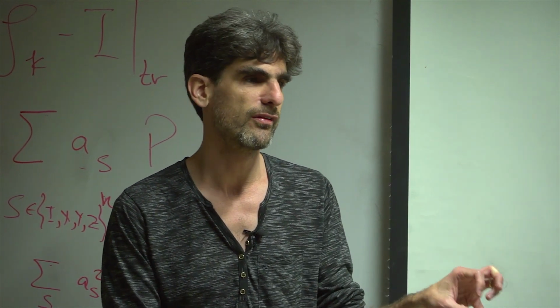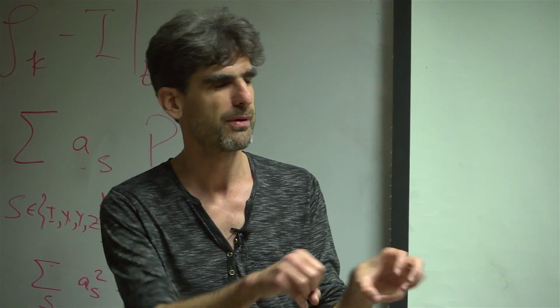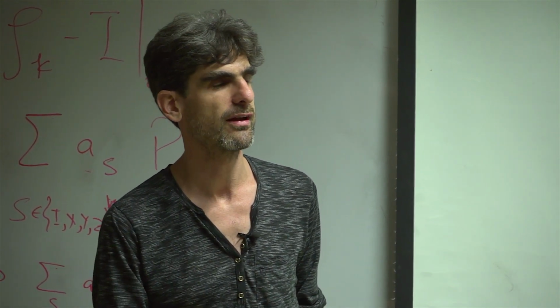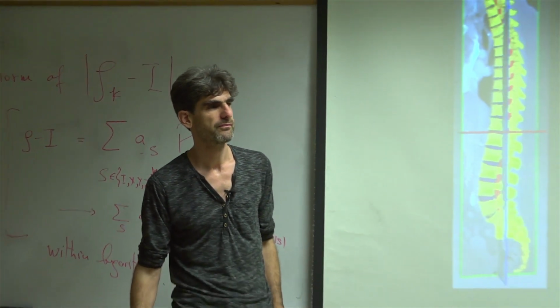So it's doing segmentation of tumors and then segmenting the tumor again in a follow-up image and comparing the size of these tumors. That's a little computer vision to do registration and know who is who. And doing various measurements for diagnostic applications.